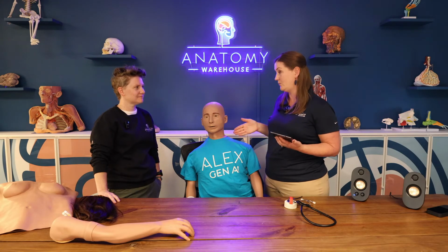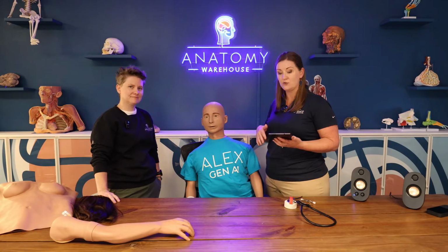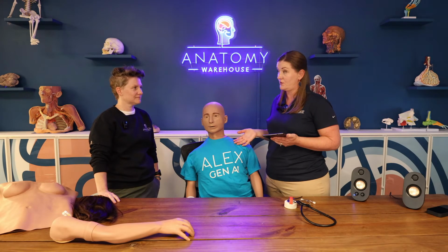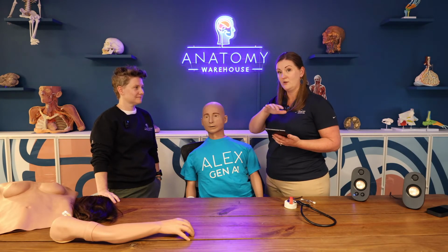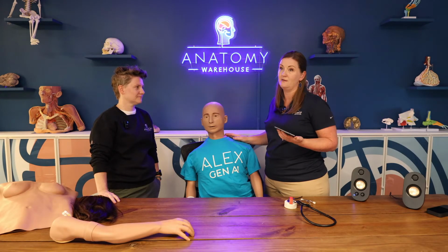So the one thing that we didn't really talk about is the fact that Alex is a cloud-based mannequin. So you can run him with this little tablet, or the instructor could run him from their office across campus, as long as what they're running the mannequin with and the mannequin are connected on the same internet service, then they're good to go.